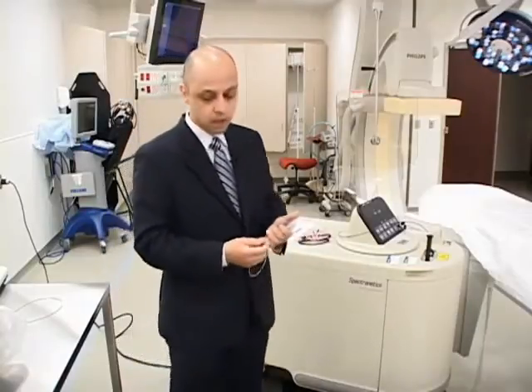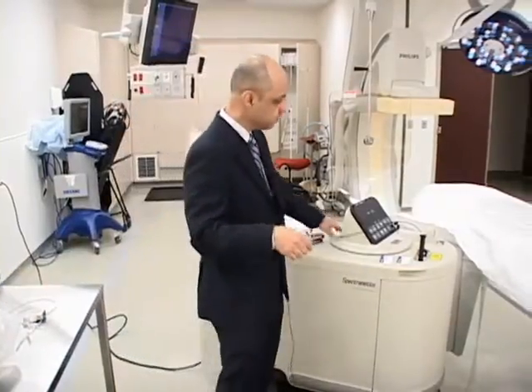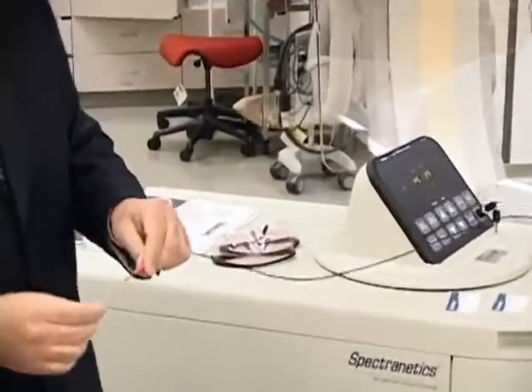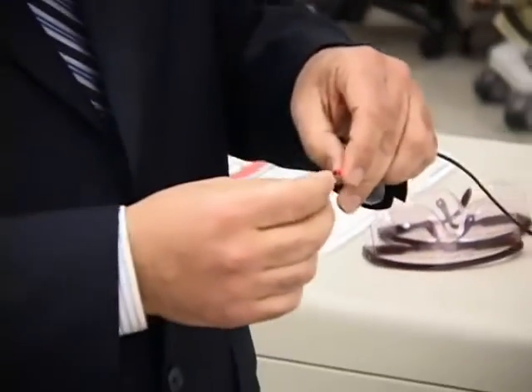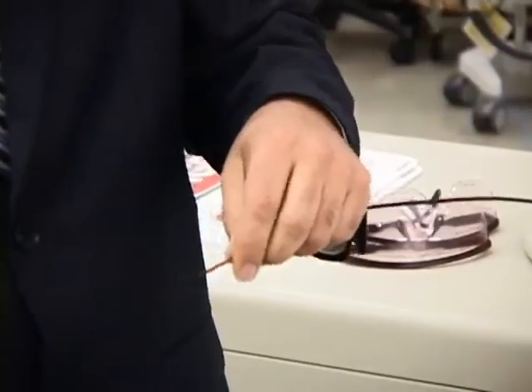We use a sheath, which is basically a flexible tube. At the tip of these flexible tubes, it can deliver laser energy. This tube, or flexible sheath, goes over the lead — this is a smaller one, but it goes over the lead.